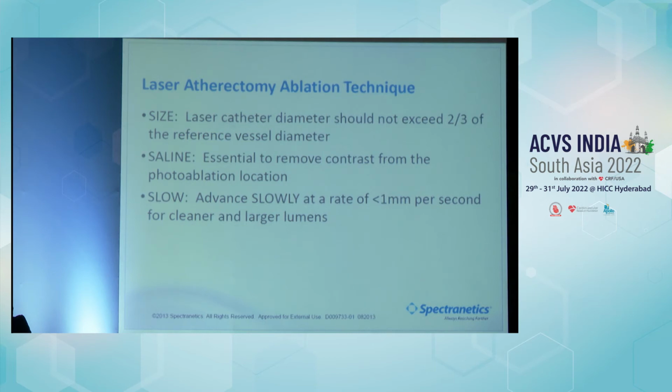Again, laser ablation technique: the size of the catheter, as I said, should not exceed 2/3 the size of the reference vessel diameter. Saline is very essential to remove the contrast from the photoablation location. If you use contrast during photoablation, there will be a lot of burn that can happen and perforations can happen. Even blood should not be there.